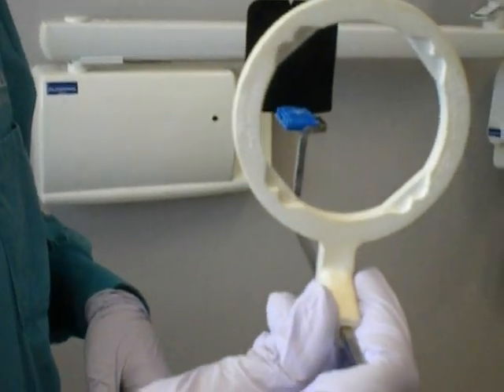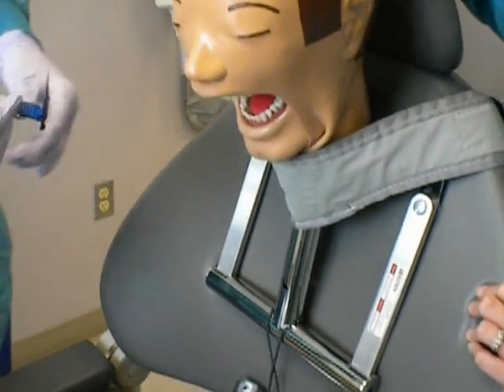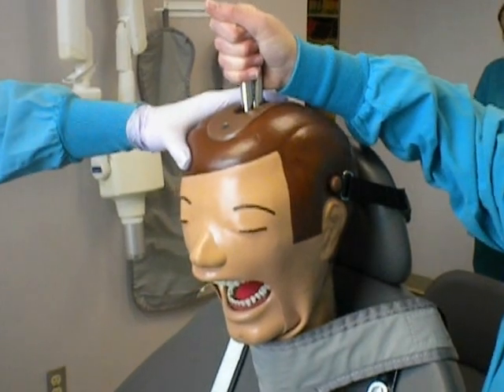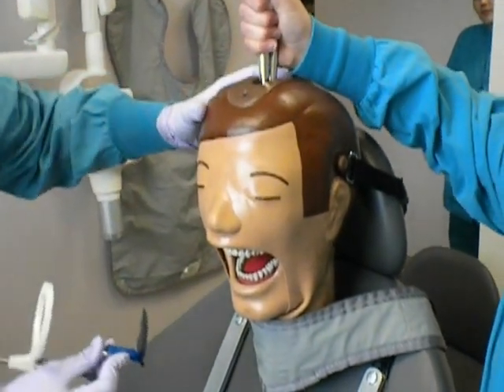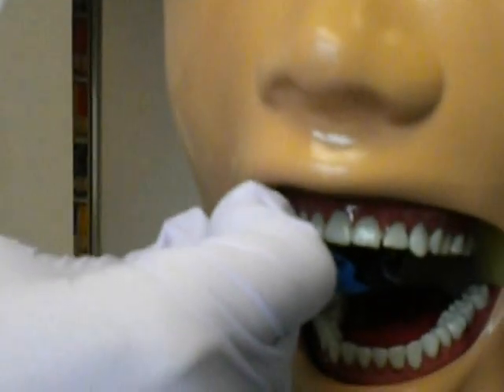Next, ask the patient to open his or her mouth and center the phosphorous plate behind the canine and lateral incisor. Make sure the bite block is also centered between the canine and lateral incisor. Then have the patient bite down.